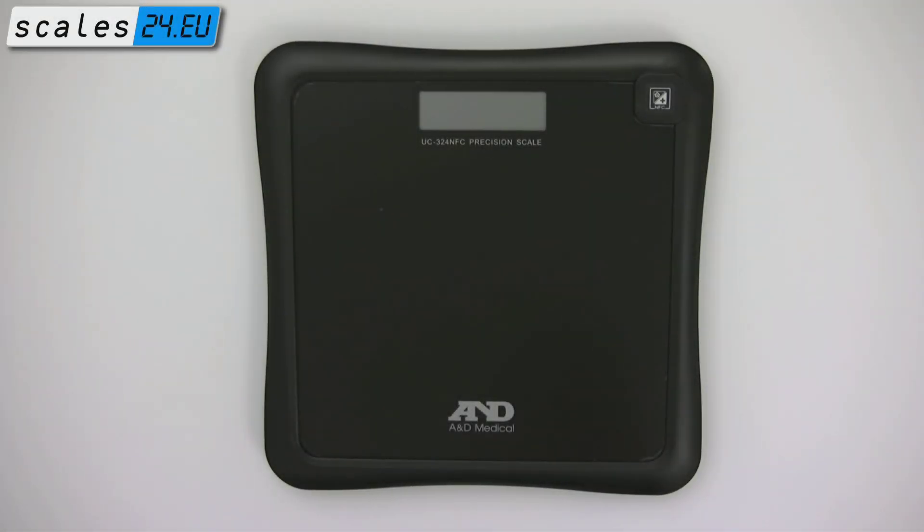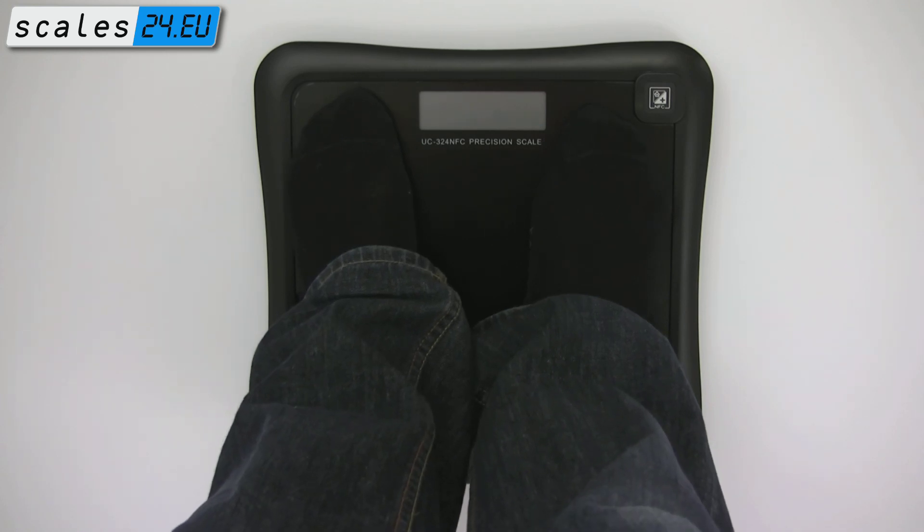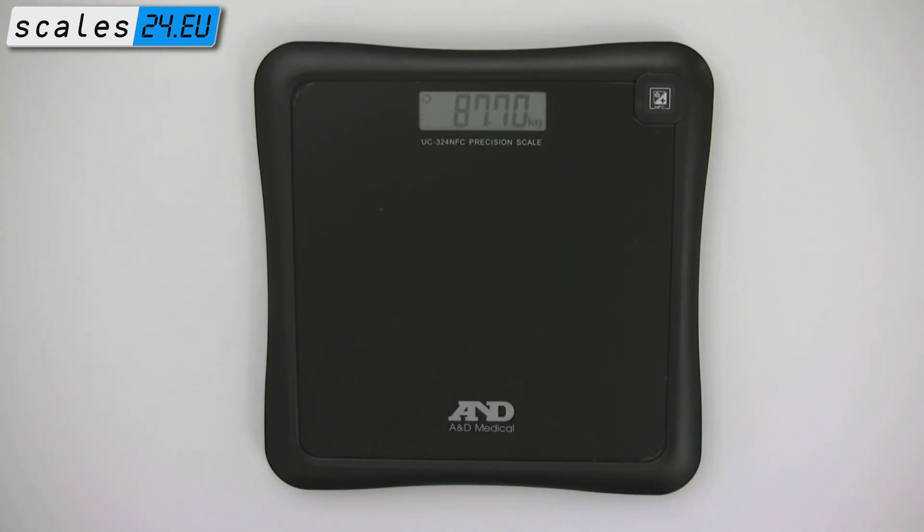To use A&D's new UC-324NFC, simply step on the scale, wait for it to complete the measurement and then step off. Your weight is now displayed for 2 minutes.